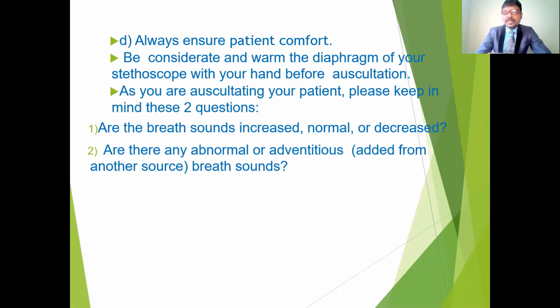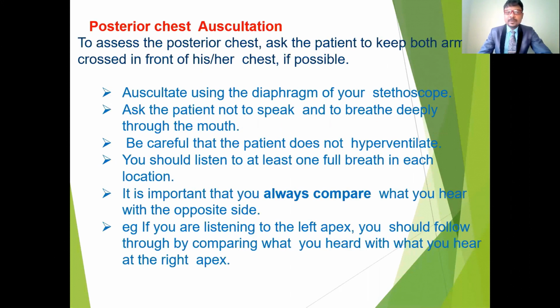As you are auscultating your patient, please keep two things in mind. First, is it a normal sound, or are the sounds increased or decreased? Second, are there any abnormal or adventitious breath sounds? These are the things we have to think about before checking the lung sounds.